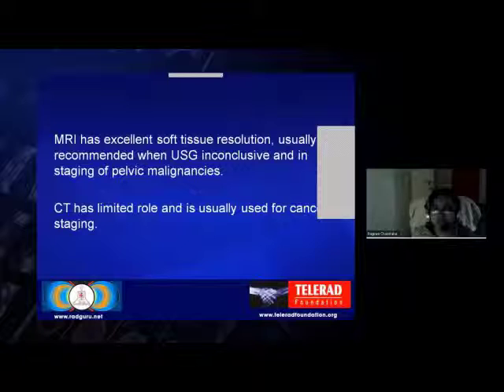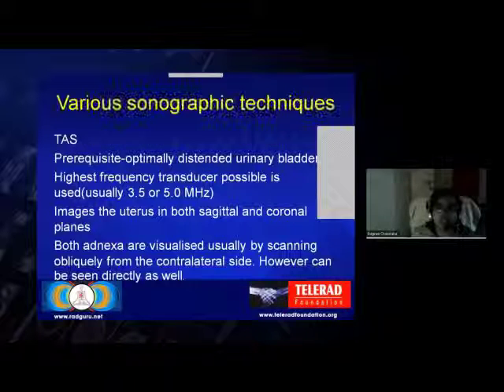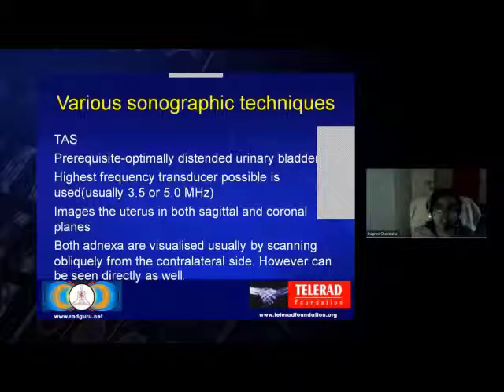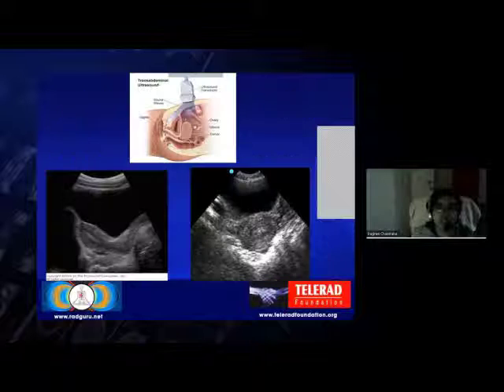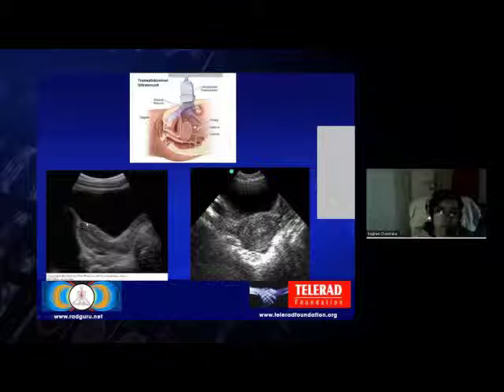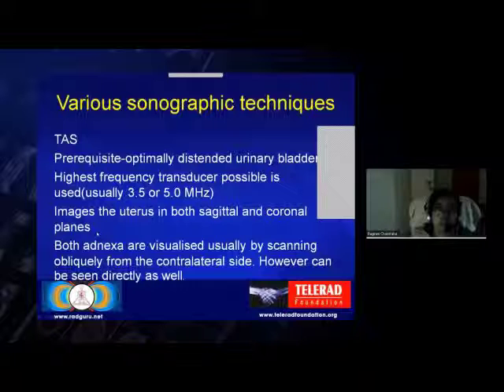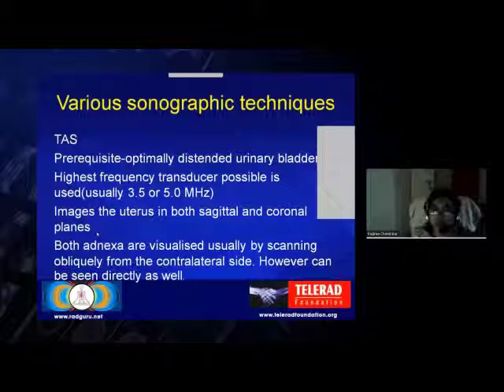Coming to various sonographic techniques, first we'll discuss transabdominal sonography, in which the most important prerequisite is the optimally distended bladder. The optimally distended bladder is the one that fully covers the fundus of the uterus, as seen in this image. The highest frequency transducer possible should be used, usually around 3.5 to 5 megahertz.